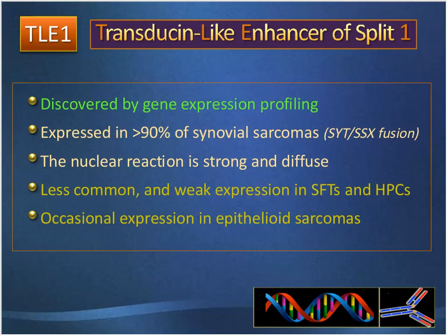Now, TLE1 is transducin-like enhancer of split 1. This one also was discovered by gene expression profiling. In more than 90% of synovial sarcomas that have the SYT-SSX fusion, it is seen. The nuclear reaction is strong and diffuse in tumors. Less common and weak expression is seen in solitary fibrous tumor and hemangiopericytomas, and occasional expression in epithelioid sarcomas.